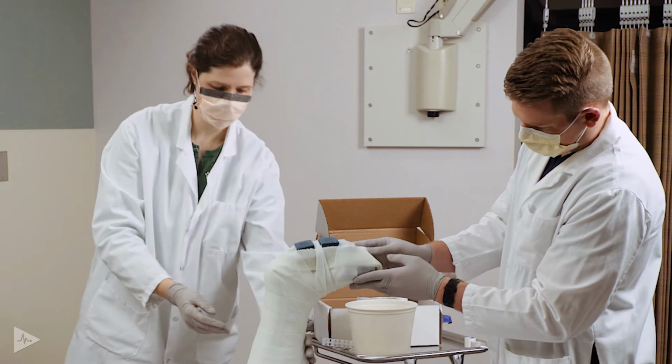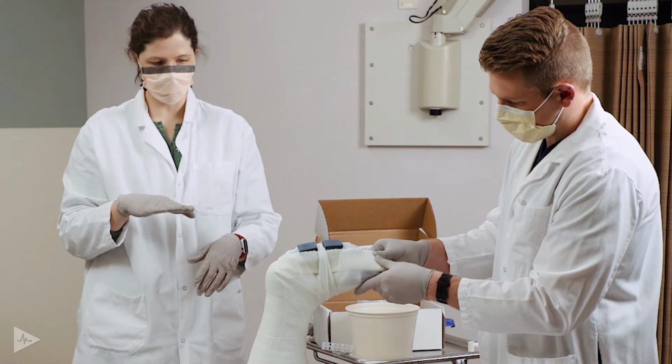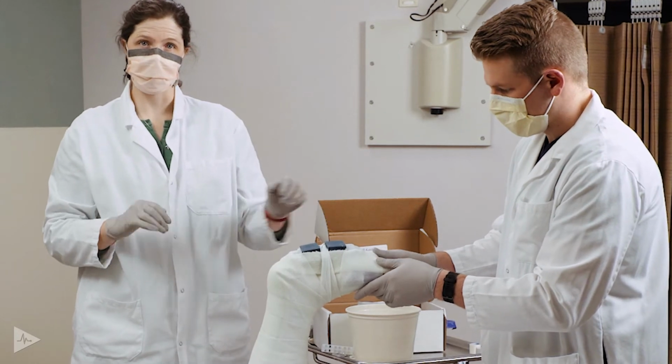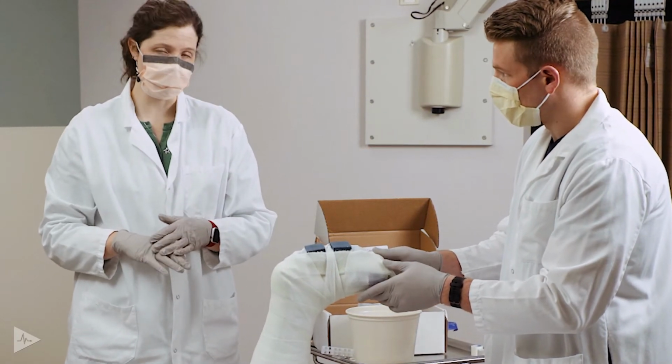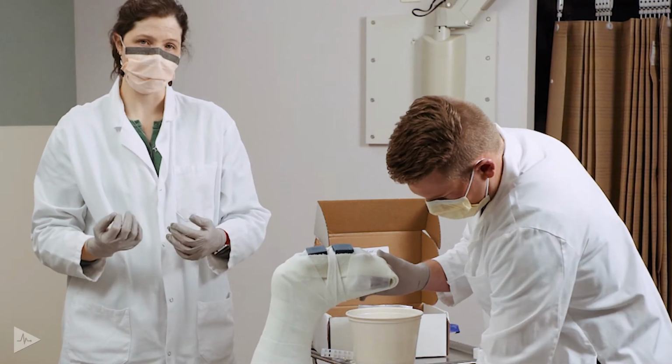That is the completion of your total contact cast. This will then have the patient roll back over and dangle their legs off the edge of the bed, and we generally will wait 15 to 20 minutes to assure the cast has solidified and dried enough for them to begin weight bearing.